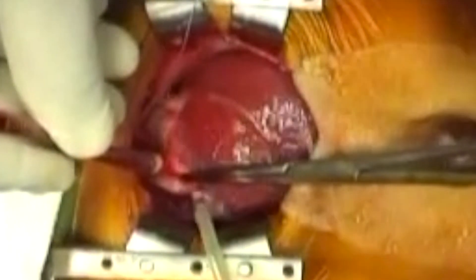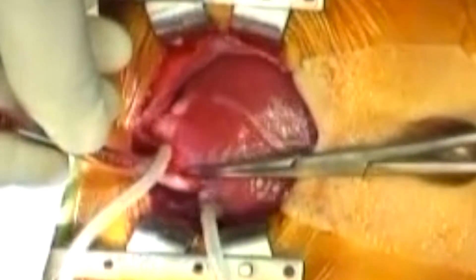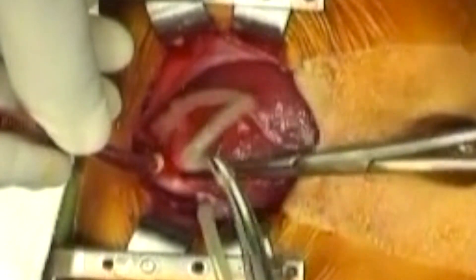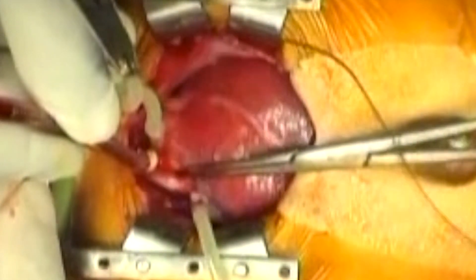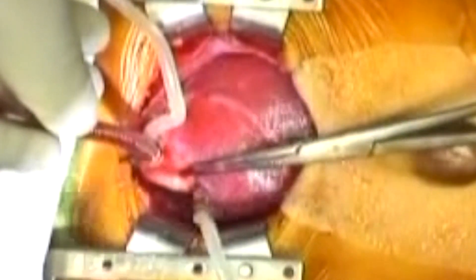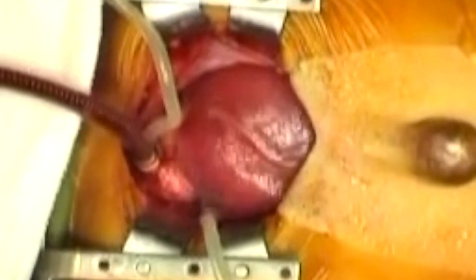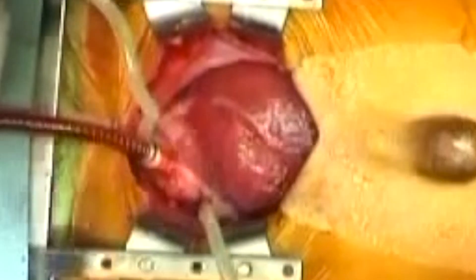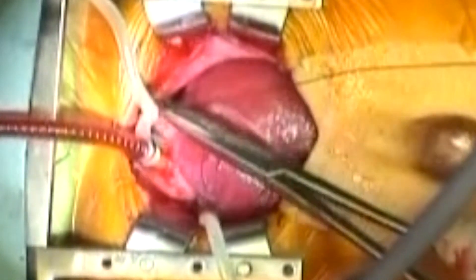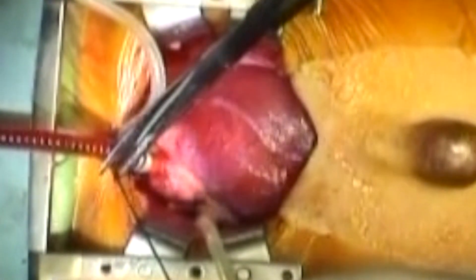The cannula is given to the assistant to hold while the surgeon snares down. Then the assistant is given both the cannula and the snare to hold while they are tied together to secure the cannulation site. Off screen to the left of the picture, the cannula is then de-aired and connected to the arterial limb of the cardiopulmonary bypass circuit. It is then secured to the top corner of the wound with a braided silk suture.